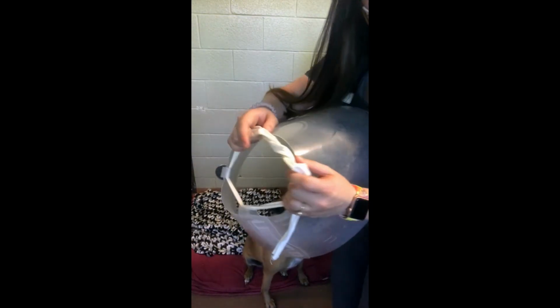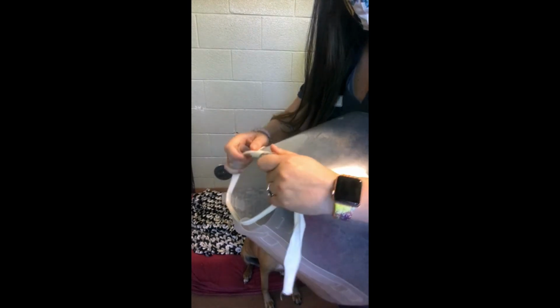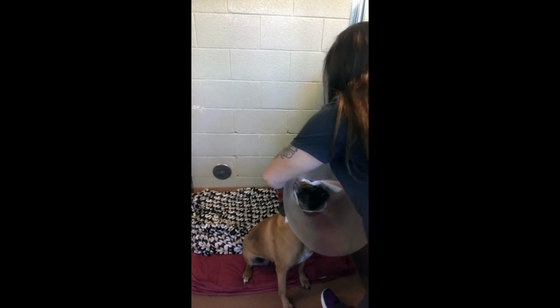If you have any collar with little tabs like this, you want to cover those. And then gently slide it over the head.